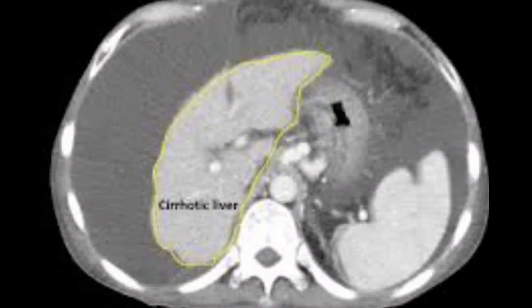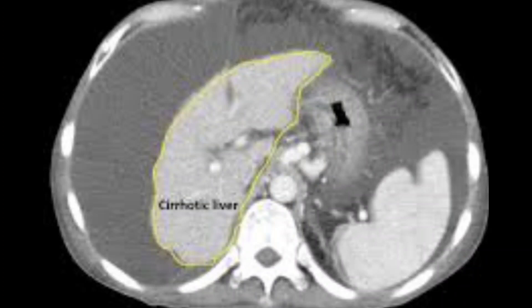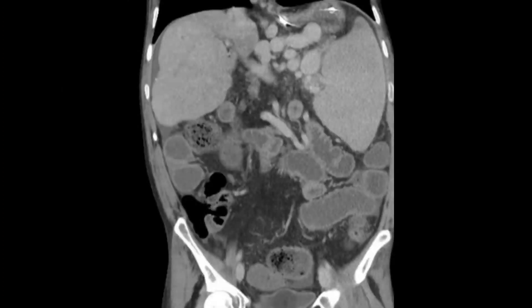This is another CT abdominal axial slice at the level of the liver. You can appreciate a small, shrunken, cirrhotic liver with marginal irregularity. Within the portal vein there is thrombus — that is the second finding. The third finding is splenomegaly. Shrunken cirrhotic liver, portal vein thrombus, splenomegaly, and moderate to severe ascites fluid seen throughout the abdomen — all these points can be picked on this CT scan confirming portal venous hypertension, including the cirrhotic liver.